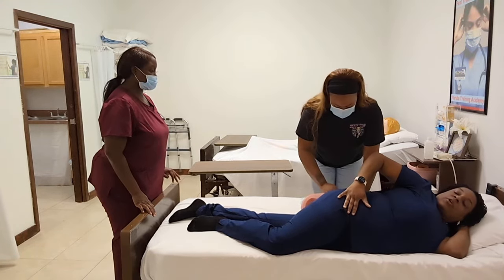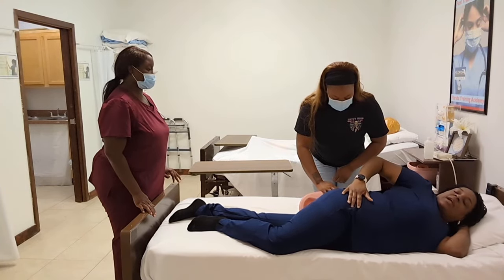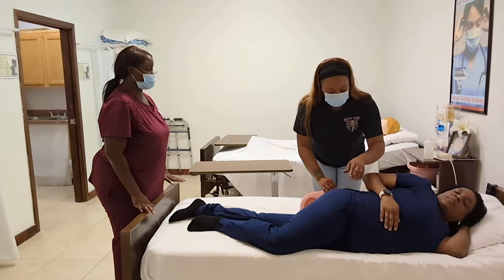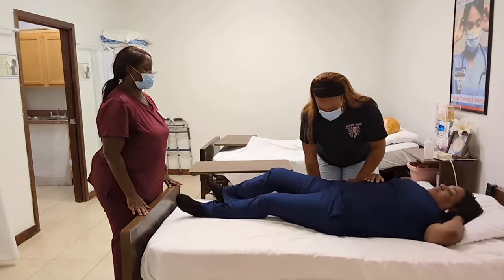Okay, now you're going to hold the bedpan with one hand. Make sure it's easy release. And with the other hand, you're going to pull my hips back on. I'm going to turn you back over, okay? One, two, three. Yeah, okay.